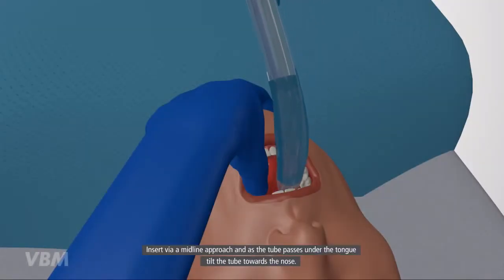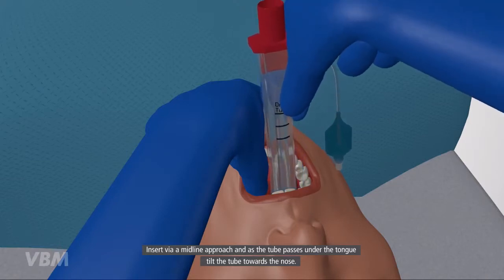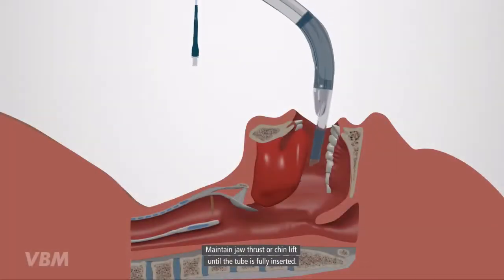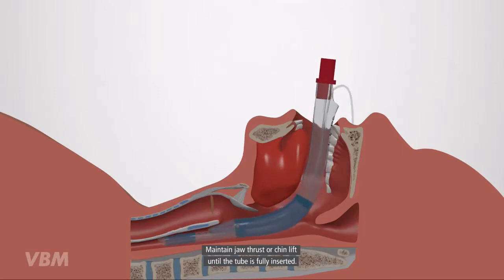Insert via a midline approach, and as the tube passes under the tongue, tilt the tube towards the nose. Advance the tube to the upper teeth mark. Maintain jaw thrust or chin lift until the tube is fully inserted.